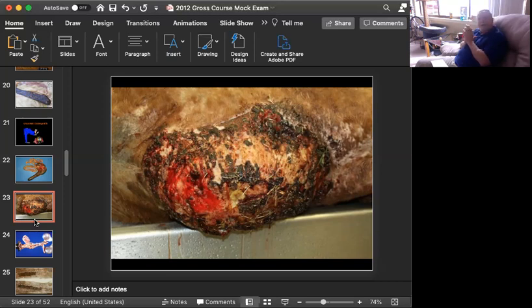The morphologic diagnosis of chronic active and eosinophilic is interesting, and I sort of reserve it for this lesion. Eosinophils are unusual. There are certain animals that like to throw a lot of eosinophils at just about everything, like pigs. Horses, not so much. But there are a lot of eosinophils in this lesion. That's why it's very pruritic. They tend to traumatize it a lot. Chronic active is a modifier that describes a lesion that has been going on for a long time, so there's a lot of fibrous connective tissue, and there are little active hotspots of this eosinophilic and neutrophilic inflammation. So chronic active and eosinophilic dermatitis is what I use for this one.